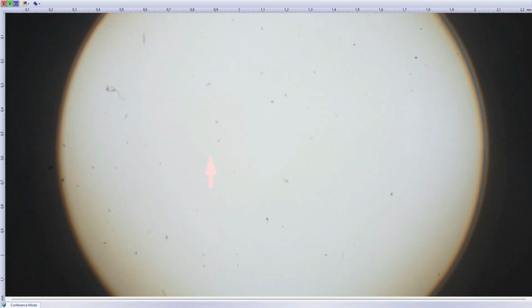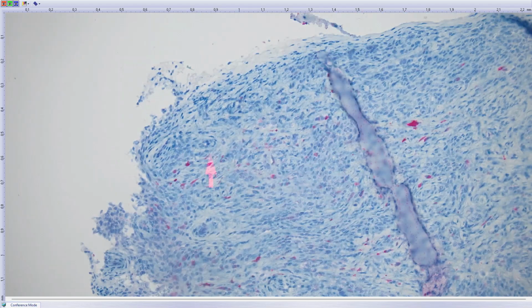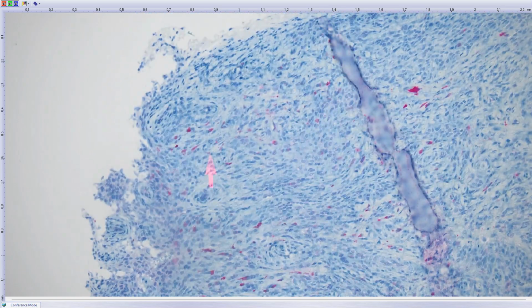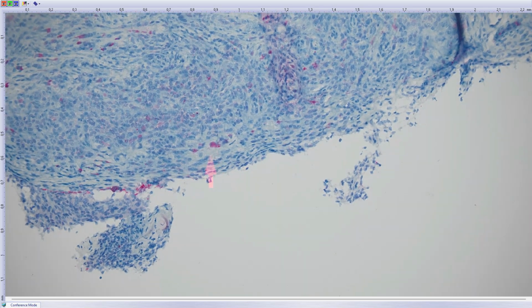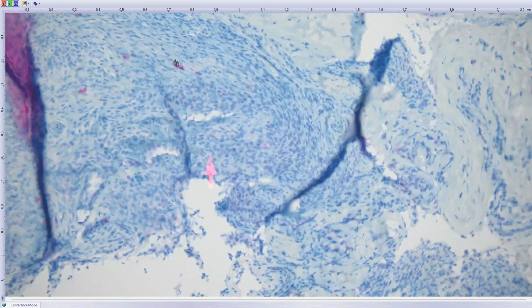And when you think of tenosynovial giant cell tumor, another good marker is clusterin, which tends to stain the actual neoplastic cells, because all the histiocytes are basically just inflammatory admixture. The tumor cells are the larger epithelioid cells which stain with clusterin, which is a marker of synoviocytes. And tenosynovial giant cell tumor is a tumor with synoviocytic differentiation. And these cells, which are positive here, there are not many, but those that are positive, I believe, such as this one here, it's perfect, are the neoplastic synoviocytes. This is of course the benign variant.